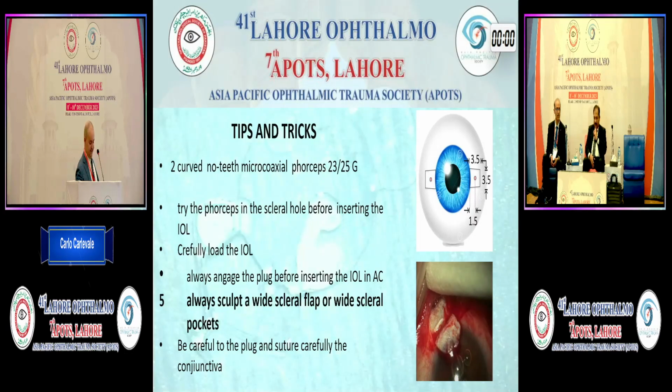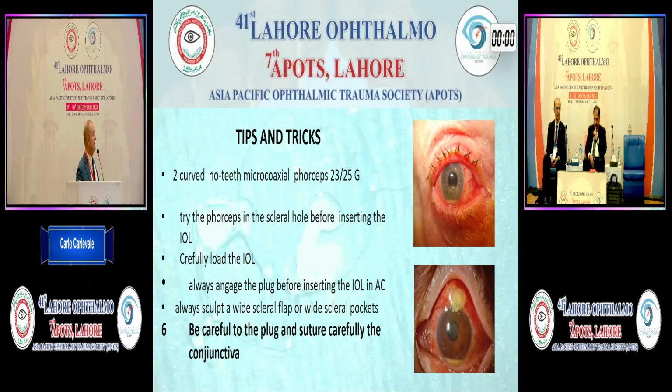It's important to protect the sclera, the plug, putting enough sclera around. Minimum 3.5 by 3.5, better 4 by 4, scleral flap or scleral pocket, same. And remember that you will always have a smaller flap than you planned, because once you sculpt the flap, the sclera shrinks, so you will have a slightly smaller size.